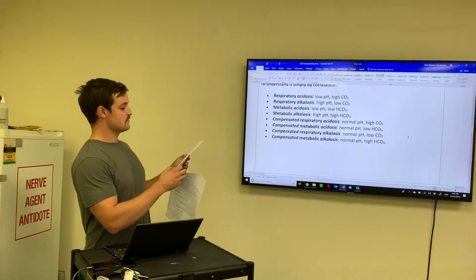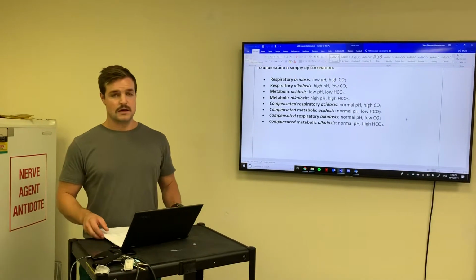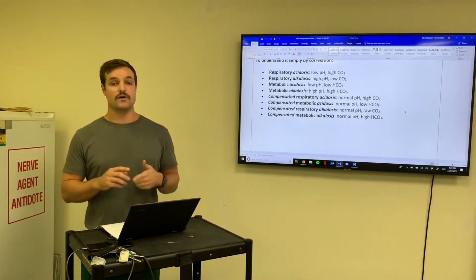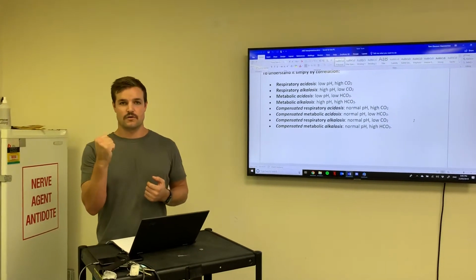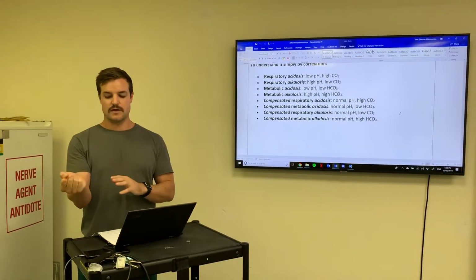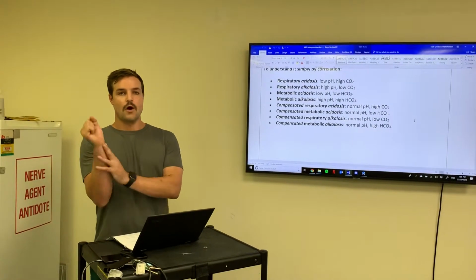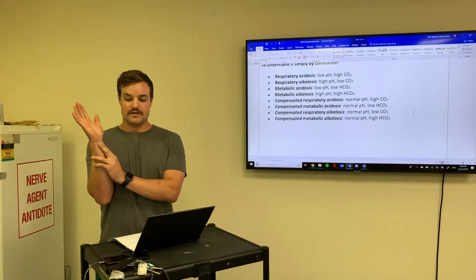We've got some considerations or contraindications for arterial blood gas collection. One of the contraindications, pretty well across the board globally, is an abnormal modified Allen's test. This is a test where you get the patient to make a closed fist, or close the hand and put some pressure on, basically getting the blood out of the hand. You then, as the person taking the blood, occlude both the radial and ulnar arteries with your fingers, and then you open the hand up and release the ulnar artery.